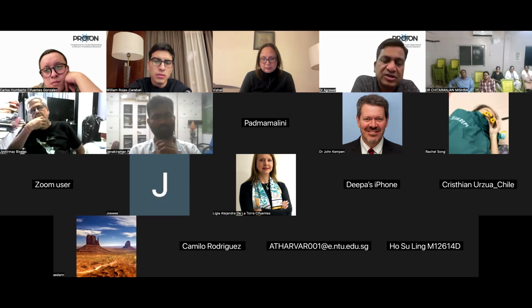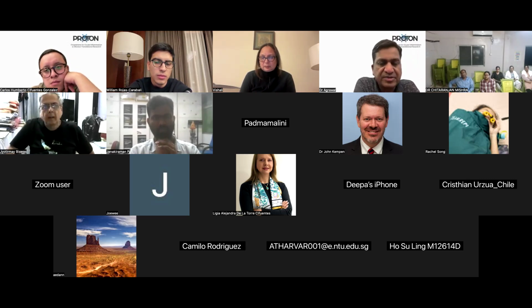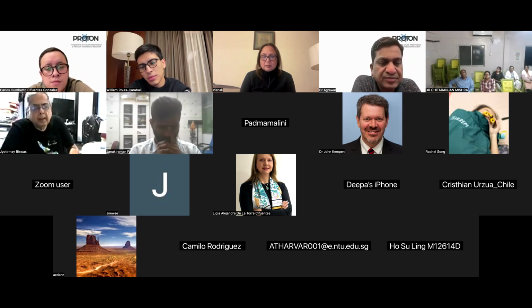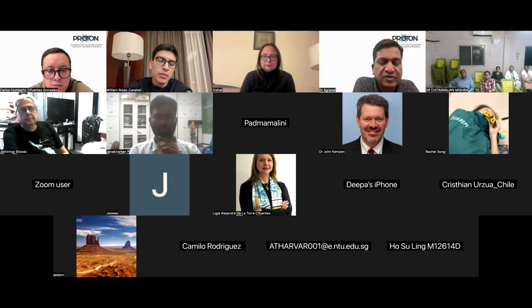I think John or Professor Alexandra, any specific comment on the wide angle imaging in uveitis? Do you have any questions, comments, or any advice for any one of us?